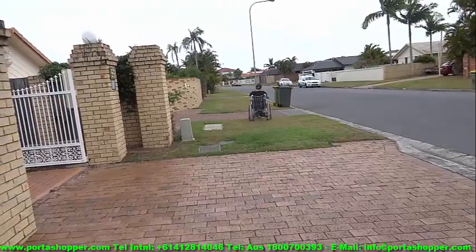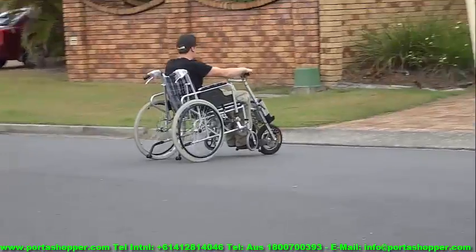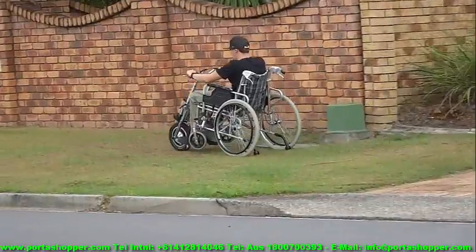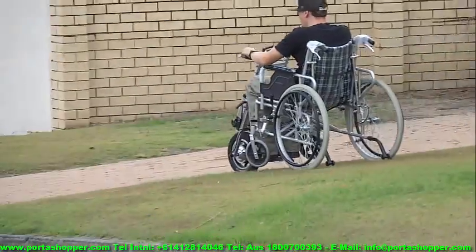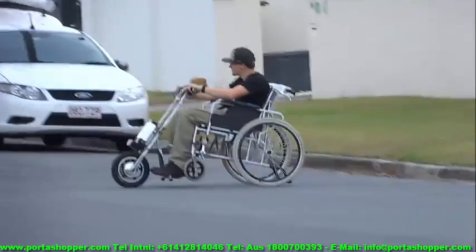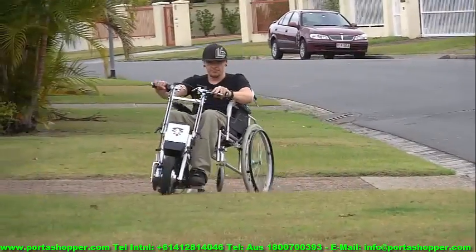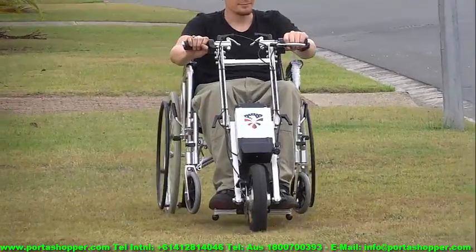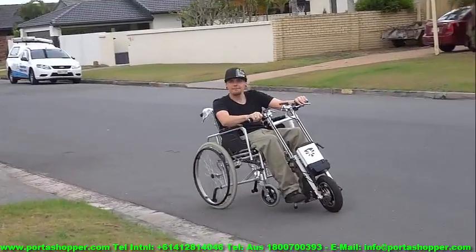Here you can see how important it is to adjust the angle of the tow bar so you have enough clearance on the casters to cross over steep driveways, gutters and other obstacles without catching the ground. This is normally achieved by adjusting the tow bar sticking out from your wheelchair to point down as low as possible towards the ground, whilst adjusting the tow hitch sticking out from the Portawheel drive unit to be horizontal or even facing downwards by 3 to 5 degrees. You can also adjust the height of the Portawheel stand to make sure that the tow hook slot lines up perfectly with the lowest bolt on the tow bar.